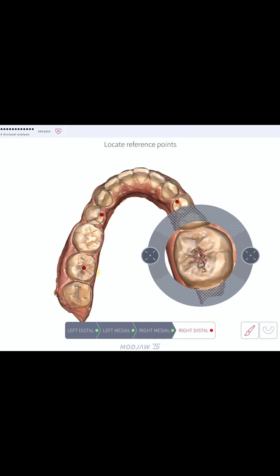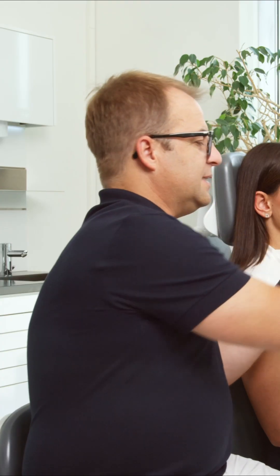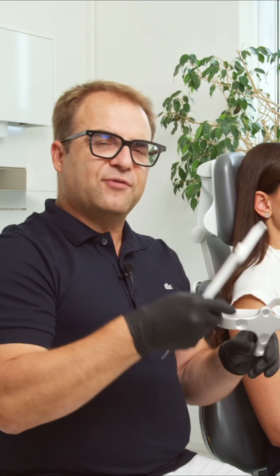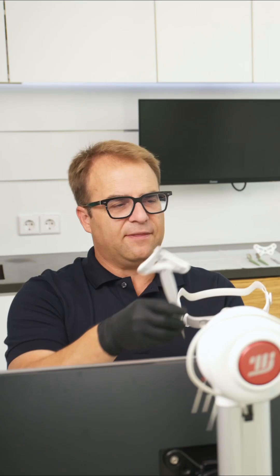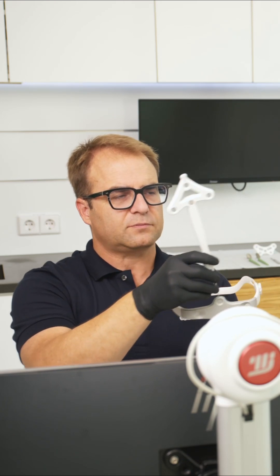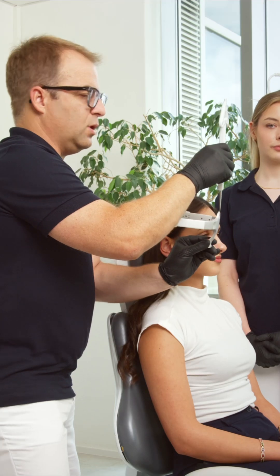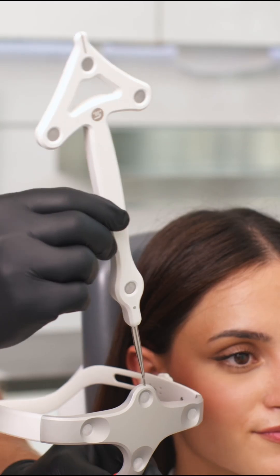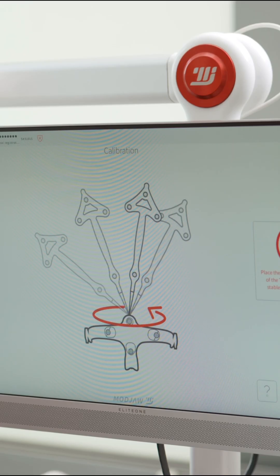In the next step, the reference points are being selected. Once the models have been uploaded and the reference points located, we proceed to calibrate the Mojo device. This involves the tiara and the wand, and I perform a rotating motion.